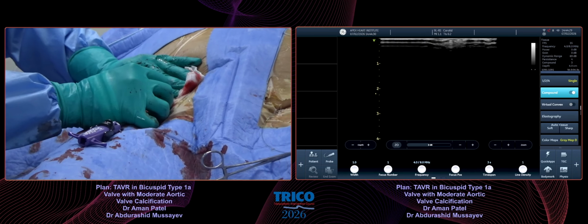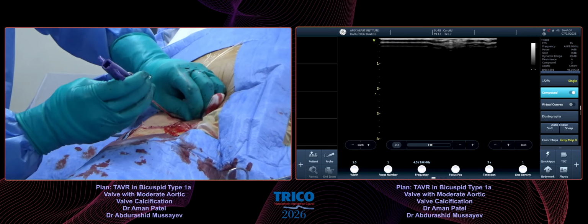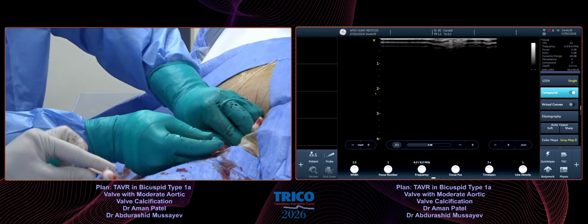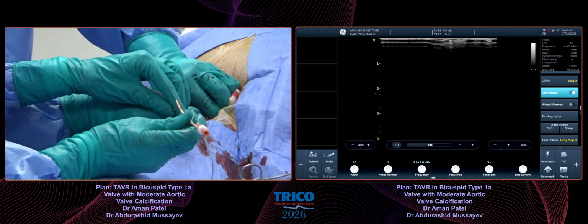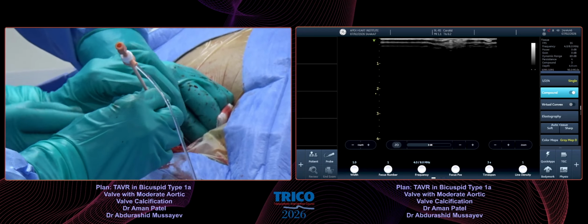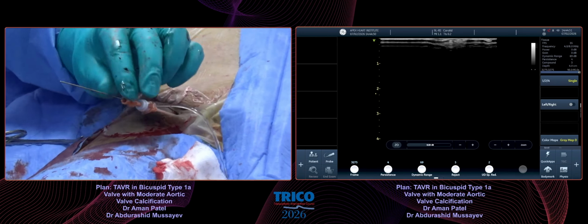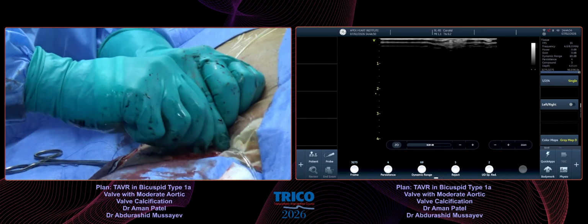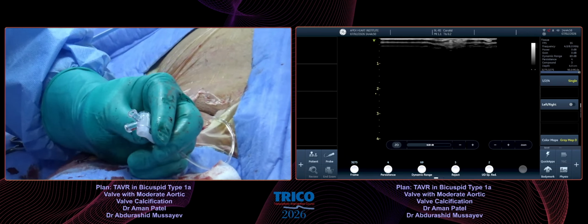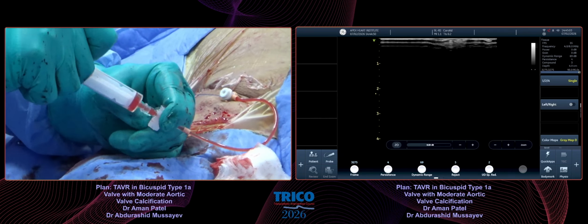And for any femoral access, because femoral access has become uncommon, I always make a very important point to all the fellows. They always have a very good cut and dissection, because if there is any oozing or bleeding from that femoral arterial access, you want it to come out and not cause a pseudoaneurysm, which can be much more fatal later. So it's a good idea always to get a good dissection. Yes, and how often does it happen? Objectively, if you look back, what the literature says, at least 1% of the patients with femoral access end up getting pseudoaneurysm.